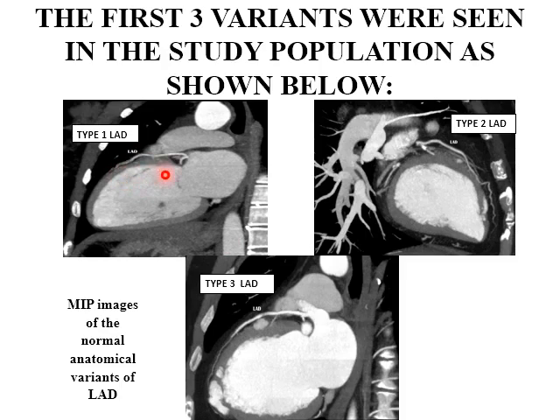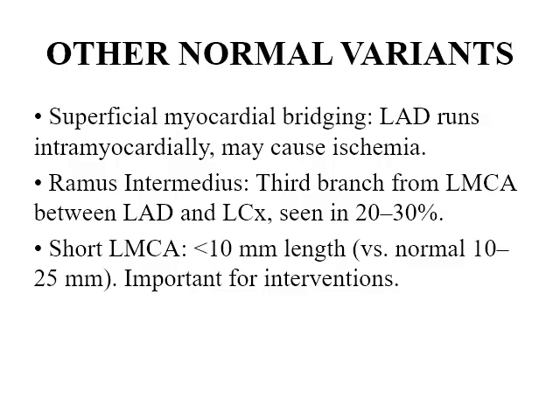We can see type 1, type 2, and type 3 on the images. Other normal variants include superficial myocardial bridging, in which the left anterior descending artery runs intramyocardially, which may cause ischemia. Another variant is the ramus intermedius, the third branch from the left main coronary artery, which runs between the left anterior descending artery and the left circumflex artery, seen in 20% to 30% of cases. There is also the short left main coronary artery, in which the length is less than 10 mm.